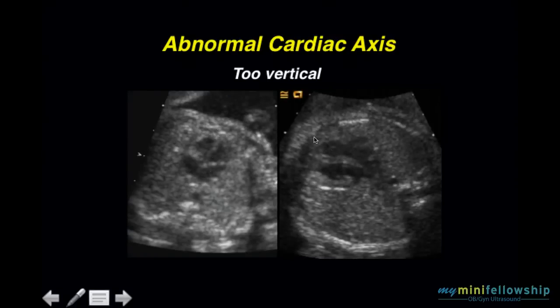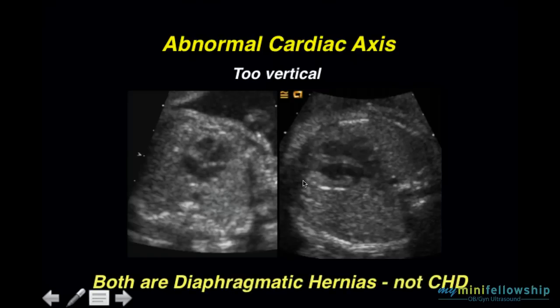Here, we see two hearts that are clearly too vertical. Now, in these two cases, both of these are diaphragmatic hernias, not congenital heart disease. The reason I show these two cases is because this case here is the most difficult congenital diaphragmatic hernia. I probably have the world's largest experience in diagnosing congenital diaphragmatic hernia, and this case here is the most difficult one I've ever encountered.